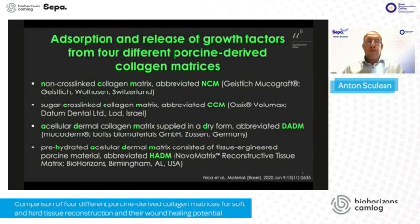So we now have, for soft tissue regeneration, a number of matrices that can be used and have already been introduced into daily practice. For example, a non-cross-linked collagen matrix, abbreviated as NCM. We also have some sugar cross-linked collagen matrices, abbreviated as CCM. Then we have an acellular dermal collagen matrix that is supplied in a dry form, abbreviated as DADM.